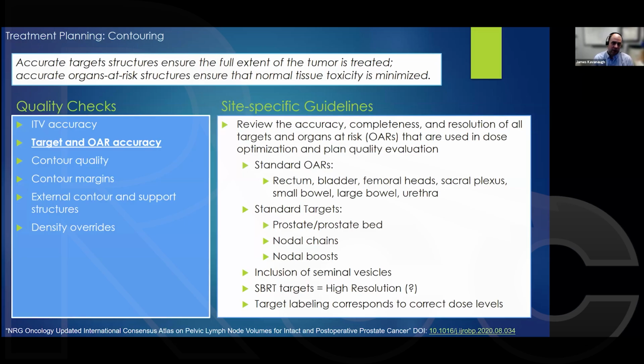Obviously, we haven't gone to medical school for 4 years and residency for 5 more for that particular purpose. And so what is a CTV and variations amongst it is not within our realm of experience. But if you've seen enough of these, sometimes you kind of get a sense of, is it different? Not that it's correct or incorrect, but is it different than what I'm expecting? And those are still important questions.